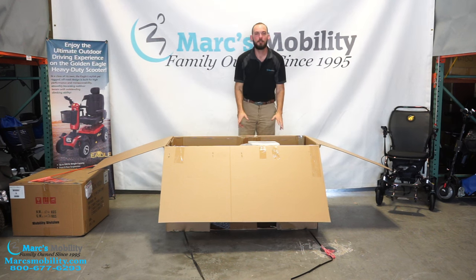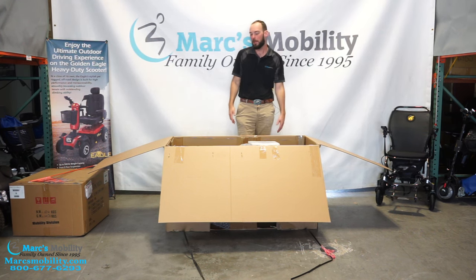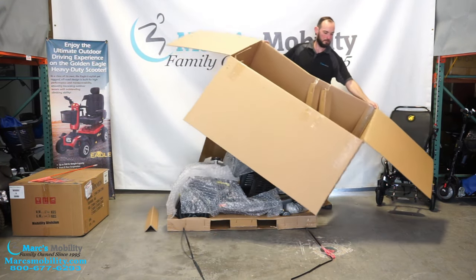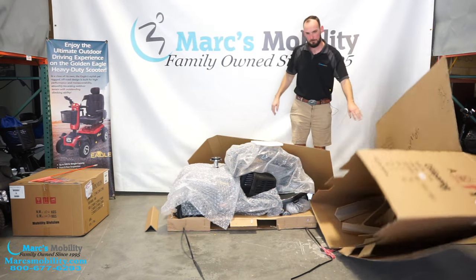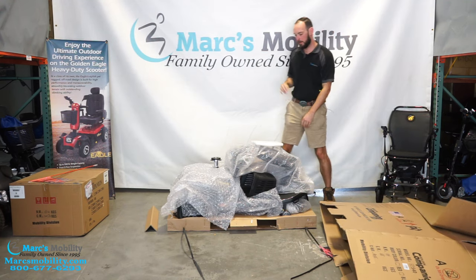To access the scooter, it's actually pretty easy. You just lift up on the whole box and it should separate from the base. And there's our scooter.